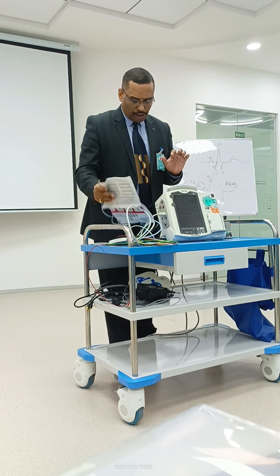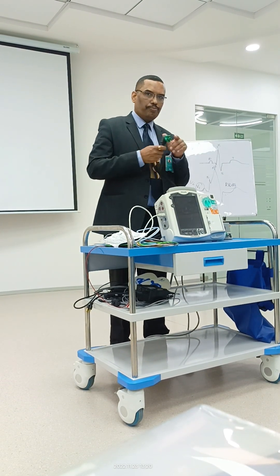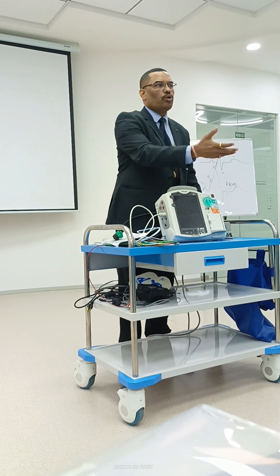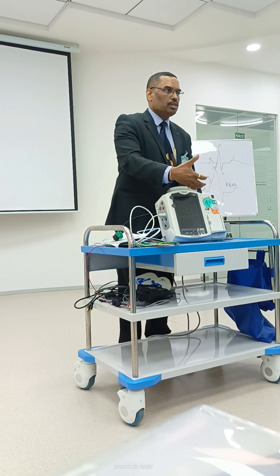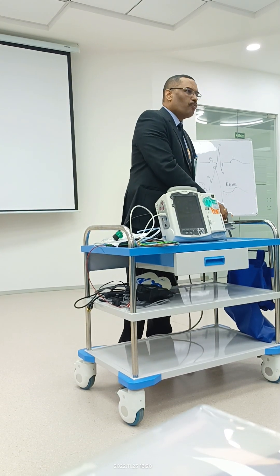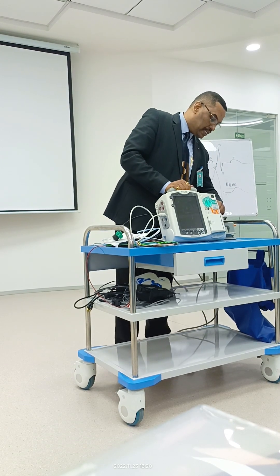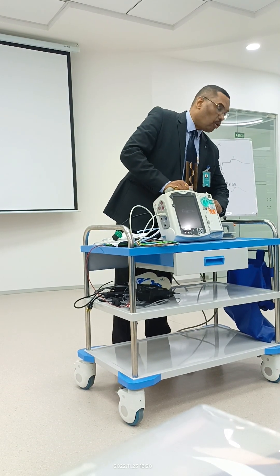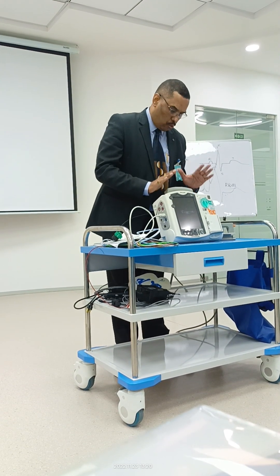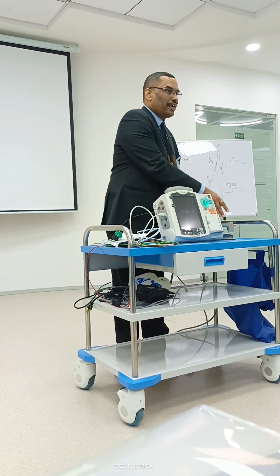Now I'm going off AED mode and switching back to regular defibrillation, so I'm disconnecting this. AED is good for laypeople or if you are not good at rhythm recognition. But for doctors, you should always go for manual mode — it's easier to operate, saves time, and you can use it instantly.